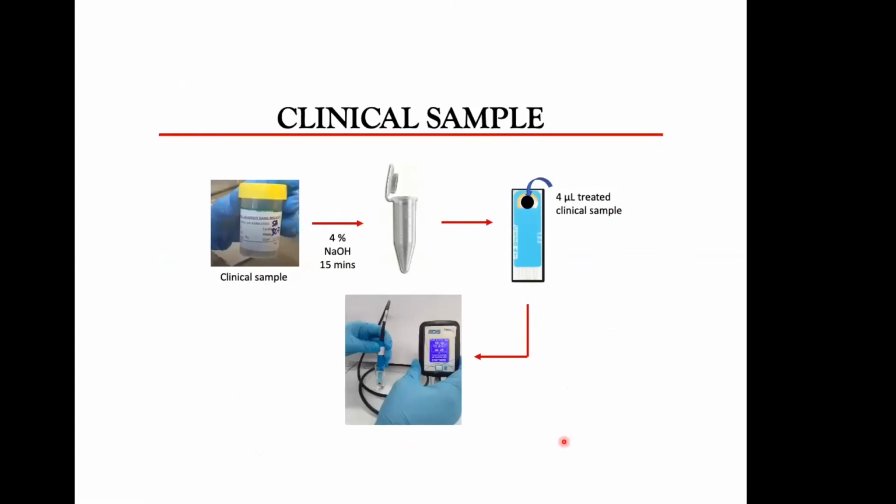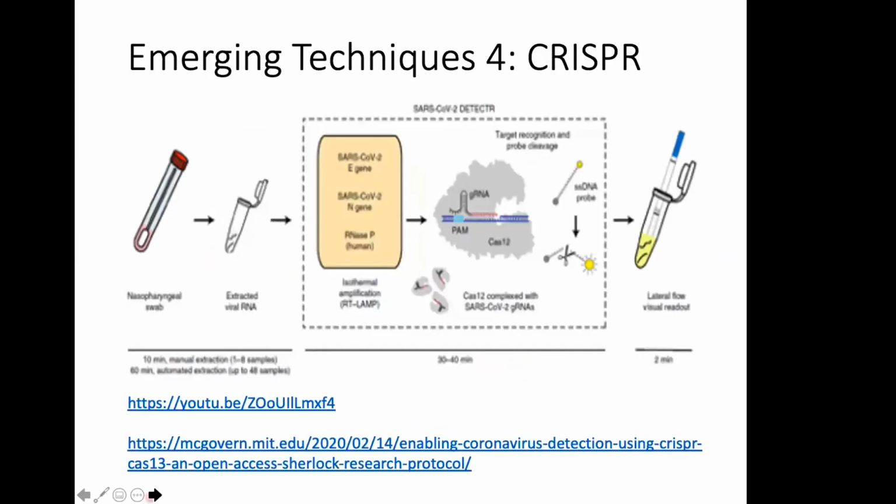And the steps are very simple. These are based on the tuberculosis detection that we have done. So you can imagine if we have the throat swab or the nasopharyngeal sample, what is needed is the breakdown of the sample by using sodium hydroxide and incubation, okay? And we can have the tagging, and it can be detected directly. Because of the incubation and the whole process, it actually took around 1 hour, 1.5 hours.